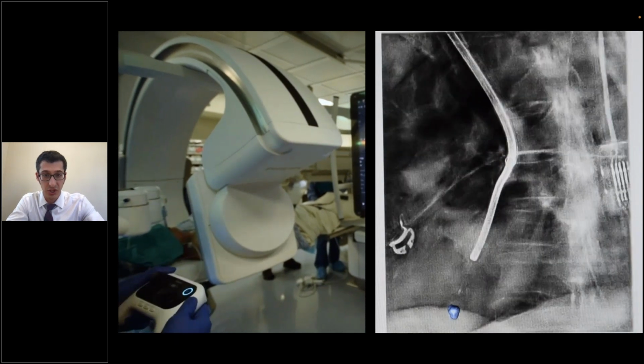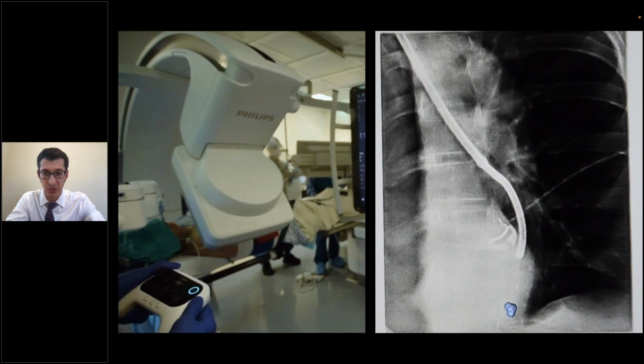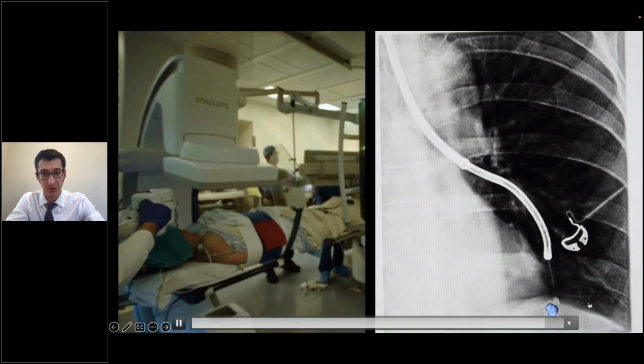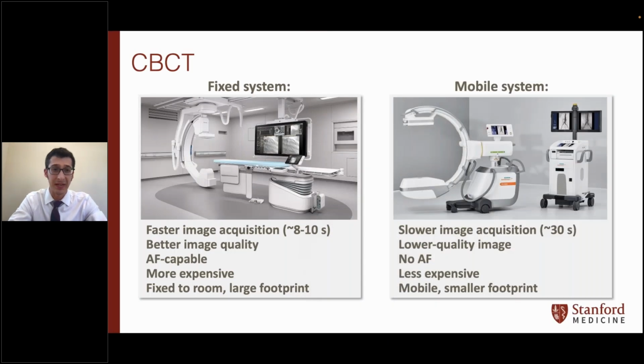And so this is just showing rotating the C-arm as we move the scope closer and as we move our biopsy instrument closer toward that augmented fluoroscopic target, which ideally should correspond to our actual target. And once you get there, you do another spin and you see where you wind up, and then you can always make adjustments based on that.